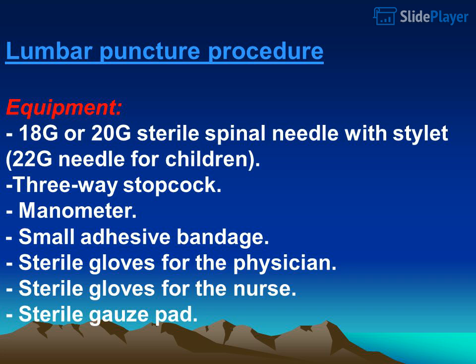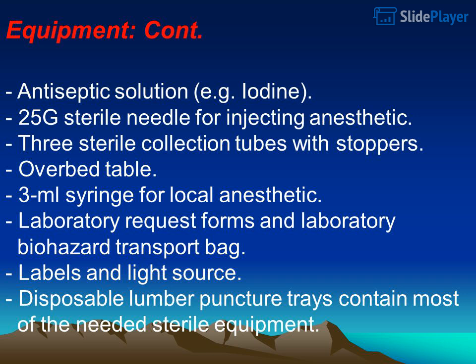Equipment: 18G or 20G sterile spinal needle with stylet. 22G needle for children. 3-way stopcock. Manometer. Small adhesive bandage. Sterile gloves for the physician. Sterile gloves for the nurse. Sterile gauze pad.